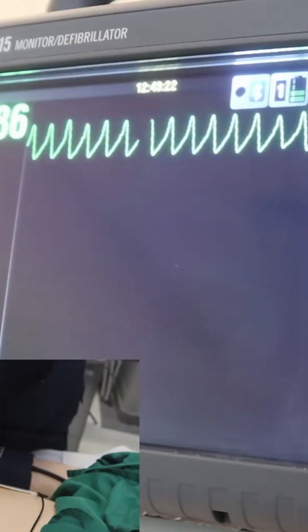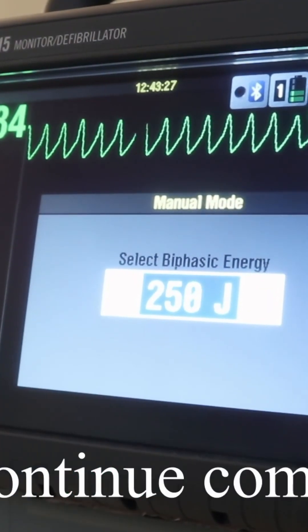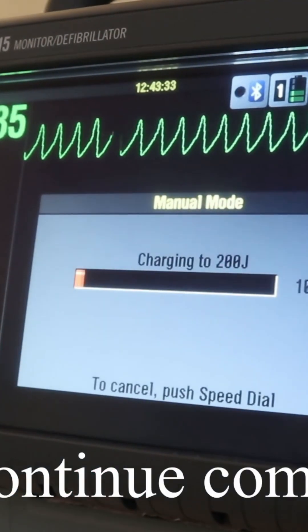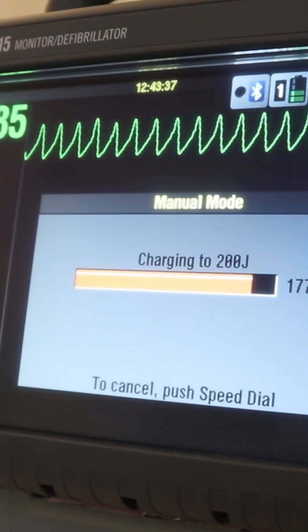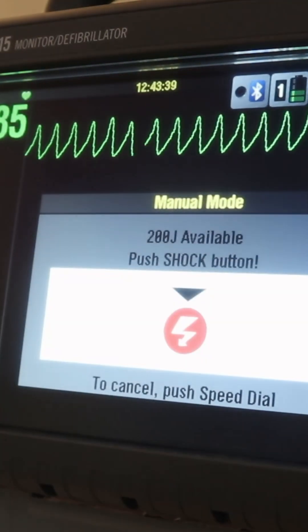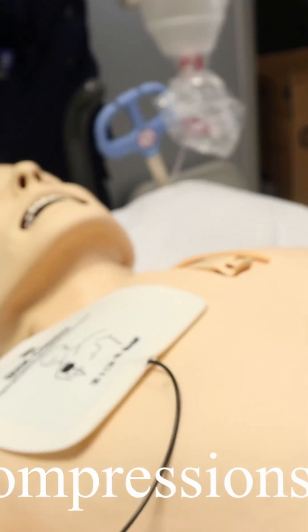Do not stop compressions unless the machine is charged. Let's see how to give external defibrillation successfully. Initially I have to select the proper joules, then I will charge the defibrillator. I will make sure the oxygen is disconnected. If using paddles, apply firm pressure to decrease the transthoracic resistance.